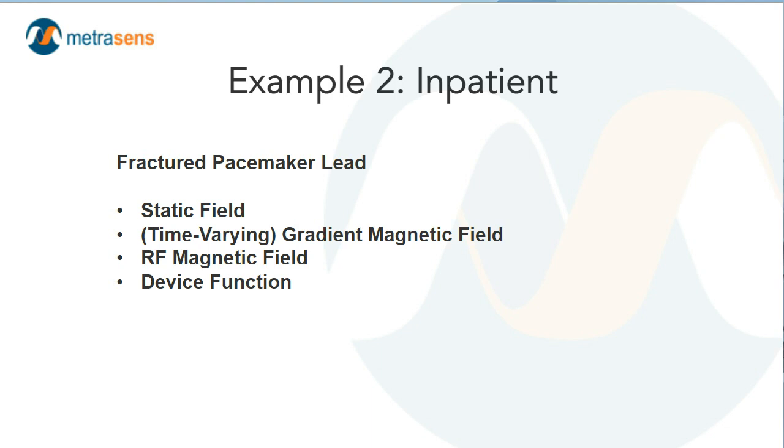But depositing RF in the knee, you are not going to get meaningful, risky amounts of E field traveling all the way up to the upper chest. So that's really not an issue.